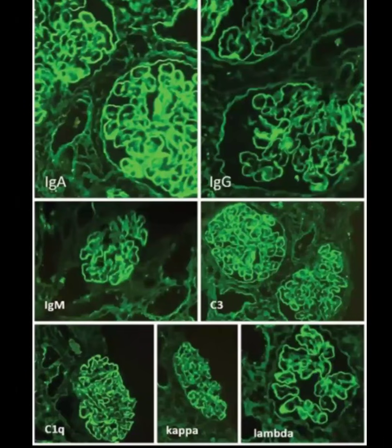MPGN. So sometimes there is a full house pattern in which you can see IgA is dominant, IgG is dominant, IgM is present, and C3, C1q, kappa, and lambda are present. So what is the disease that presents with the full house?